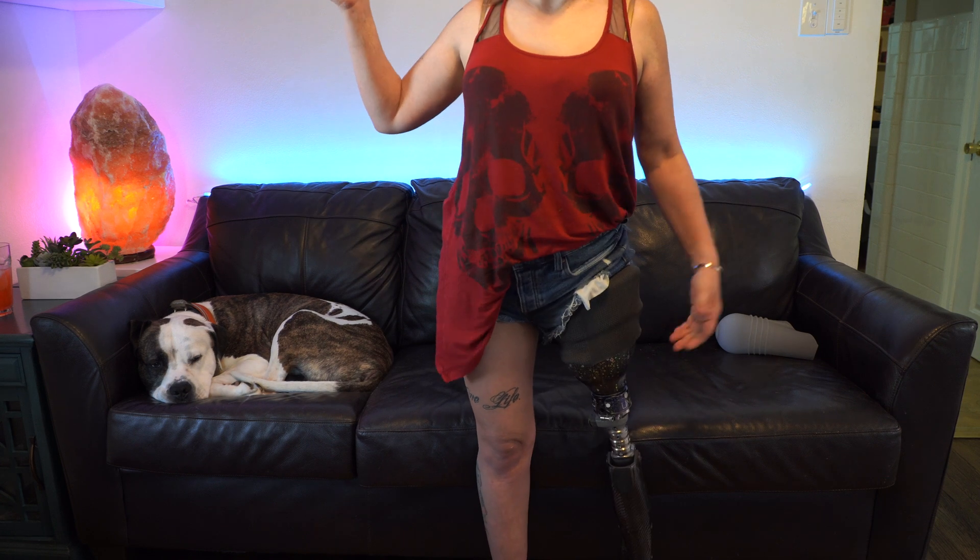And then my leg's on. The advantage, in theory, of this type of system is that you will have a full vacuum along the entire length of the socket. However, it didn't really work for me for two reasons. One is that even the smallest amount of sweat in my residual limb caused my leg to just fall off — my liner did not want to stick to my skin at all if it was even a little bit wet.